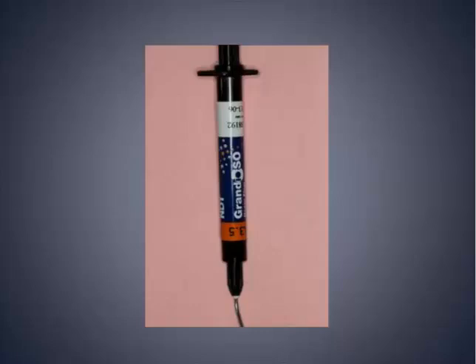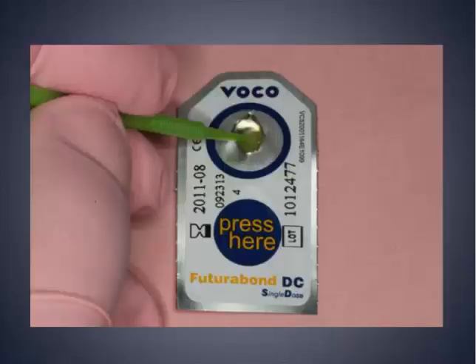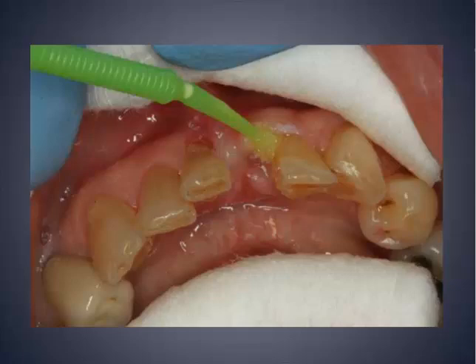It works great with Futura Bond DC and the Grandioso Heavy Flow — the three form a perfect match together. You can either etch those teeth with phosphoric acid first and then apply the Futura Bond DC, or you can just use the Futura Bond DC alone. Bond strength is improved a little bit with the etch. In a bruxing situation like this — if she clutches because of her Parkinson's — I would tend to use etch in this spot. So: phosphoric acid etch for 10 seconds, then Futura Bond DC for 20 seconds, air dry, light cure, and apply onto the teeth — buccal, lingual, and approximately wherever I'm going to use my fiber.